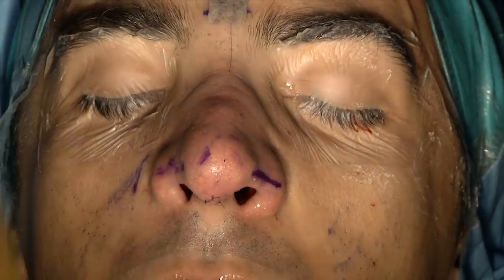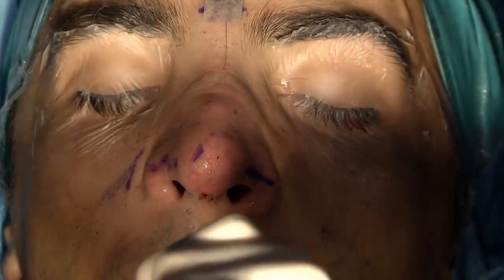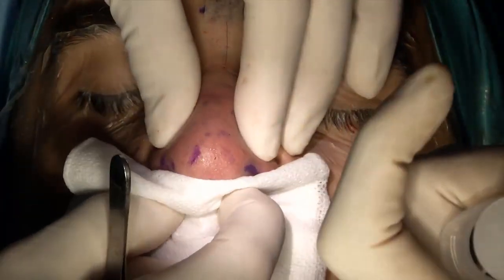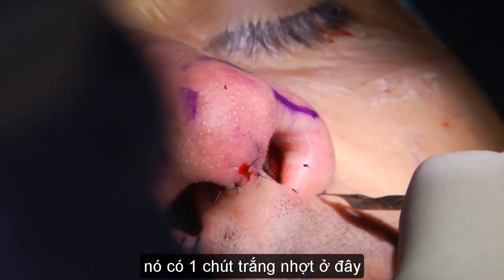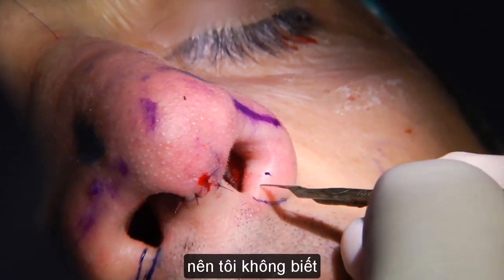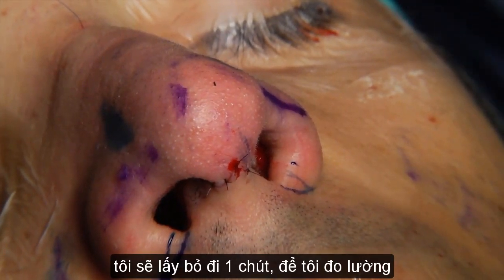You know, there's no real truth here, it depends. It's a little whitish here. So, I don't know, I will just take out some of that. Let me measure it.